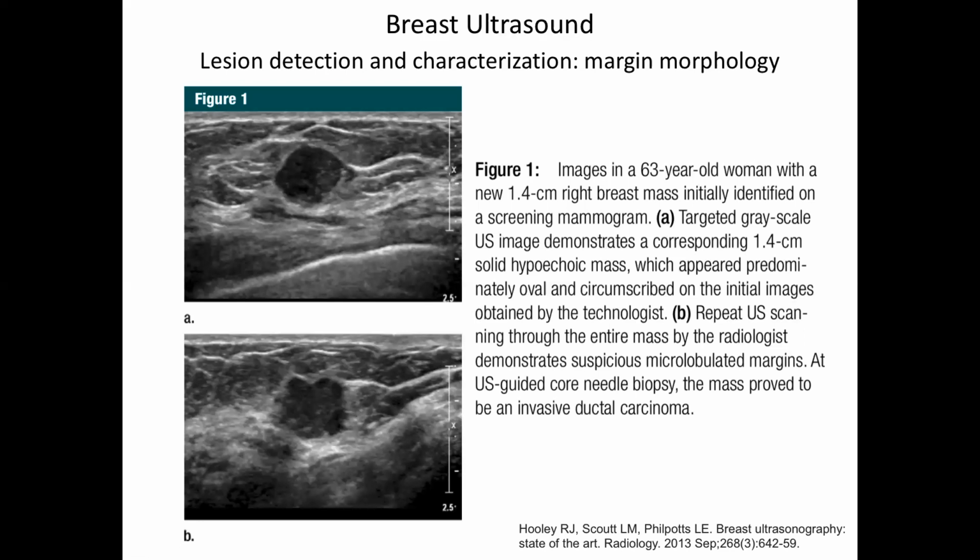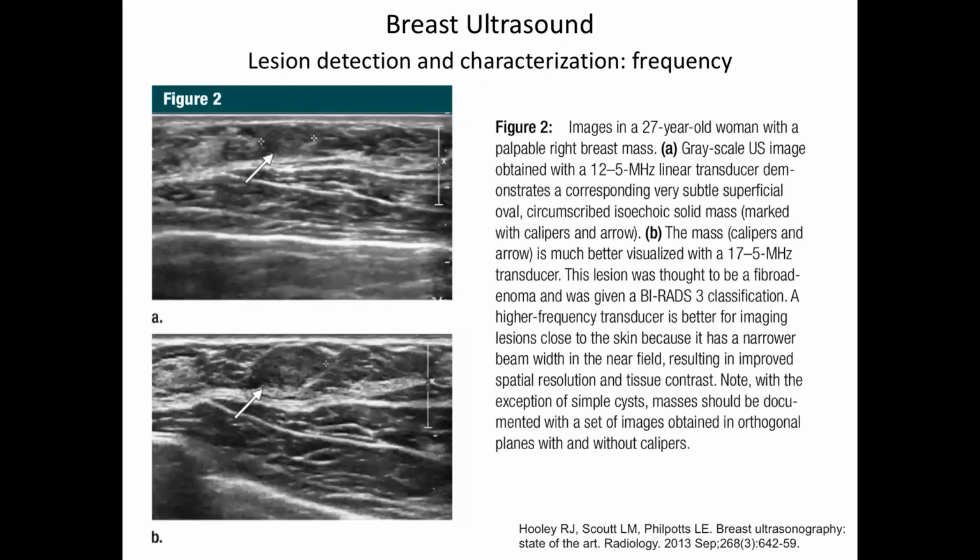So that means that it's not a sort of smoothly contained mass. It's shooting out some tissue. So that would say, oh, okay, we're gonna biopsy this thing, and we'll see what kind of cell it is. Because with histology now, if you suck these cells out, they are very familiar with all the different types of breast cancer, and they'll be able usually to classify it.